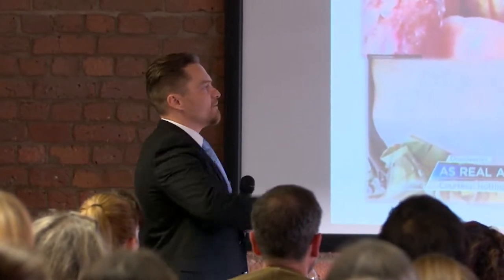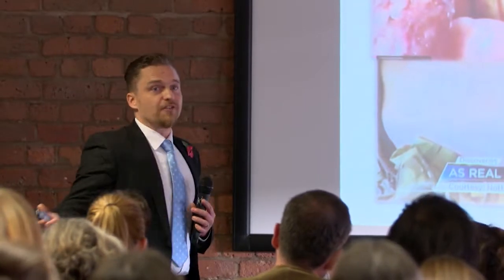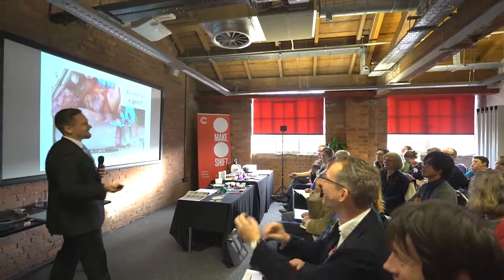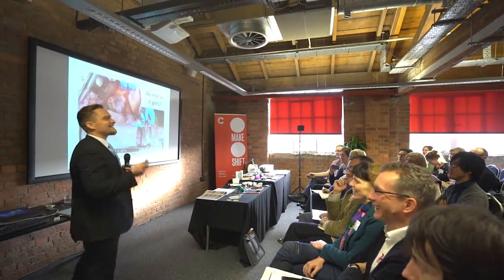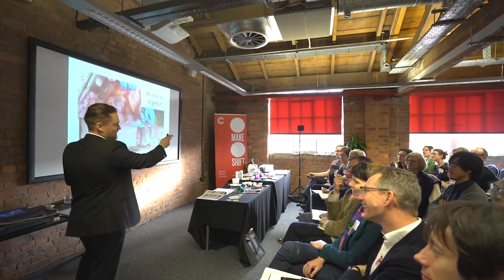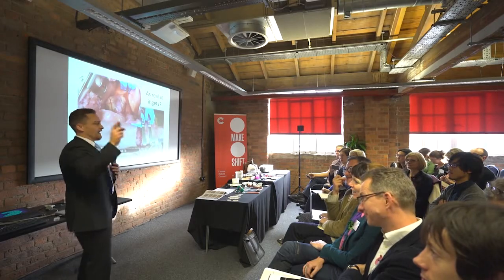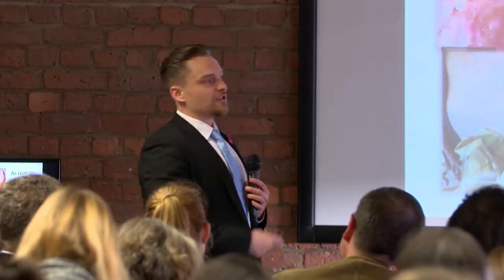How can we expand this to become a fully simulated body, which you literally can stick in 2 suitcases, take around wherever you want to. Couldn't imagine the look at customs if you get searched, but the idea is to make this thing, you could take it to the street outside and practice major trauma surgery. You can stick it in a helicopter and practice these procedures whilst in the air. You're not tethered to any kind of environment or power source to make this thing work.